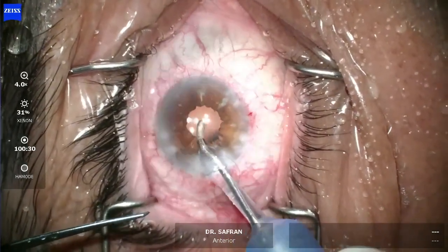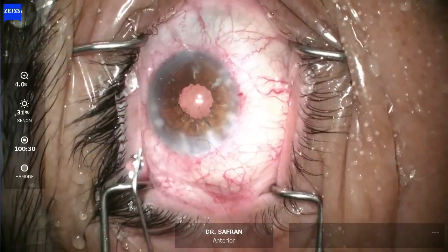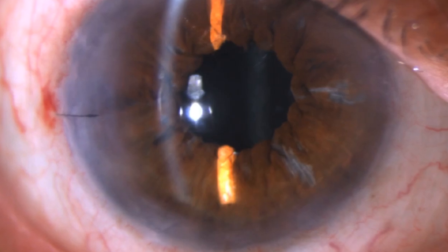I brought the pupil down to a physiologic size, removed the viscoelastic, and the case is now completed. The next day in the office at the slit lamp, the pupil looks good. There is some posterior capsule haze, but the patient is seeing 20/20 minus 2 with minimal correction. Thank you for your attention.